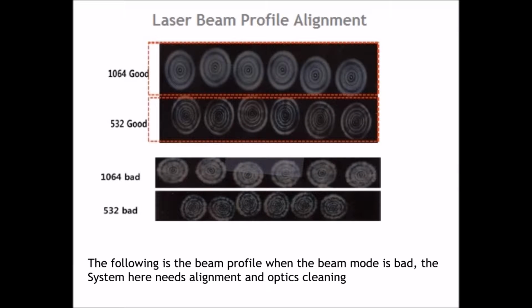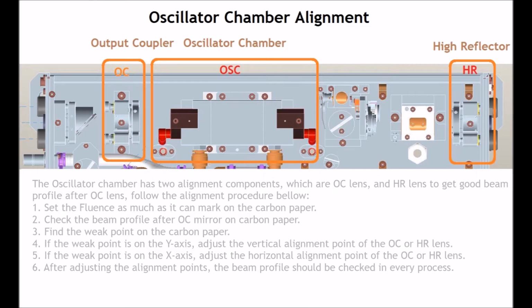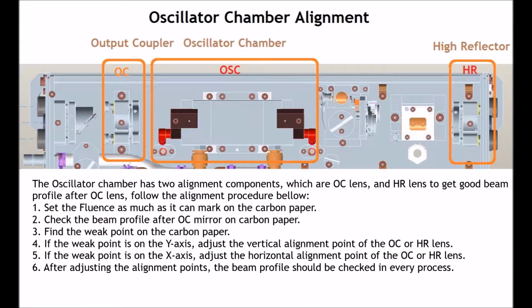The following is the beam profile when the beam mode is bad. The system here needs alignment and optics cleaning. Points of alignment. Oscillator chamber. The oscillator chamber has two alignment components, which are OC lens and HR lens. To get good beam profile after OC lens, follow alignment procedures below.